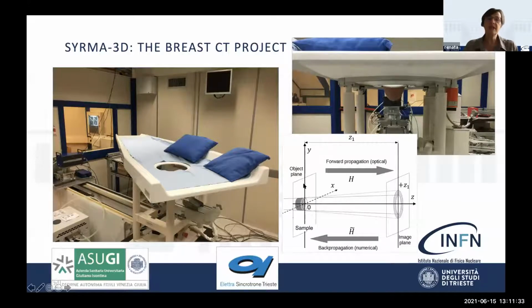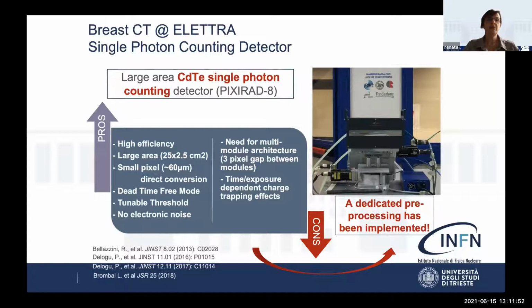In the CT project, we want to exploit not only the propagation-based imaging, but also the phase retrieval, which can also be considered a sort of numerical back propagation of the data. But let me go step by step, and let me introduce our single photon counting detector.